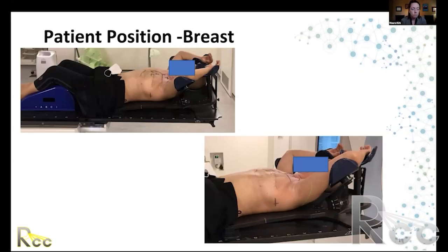so you can make sure that longitudinally the patient is in the same position on the board. And here you can see with this positioning device for the legs, you could also use an index bar, and there are different positions for the index bar, which you could record. So then you know where this device is with respect to where the breastboard is.